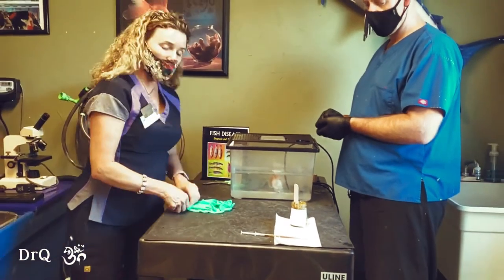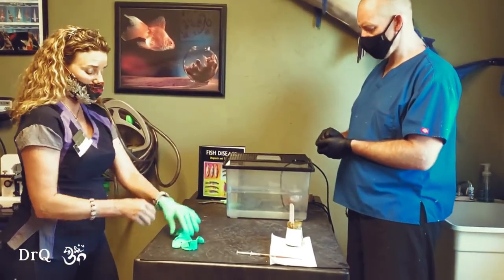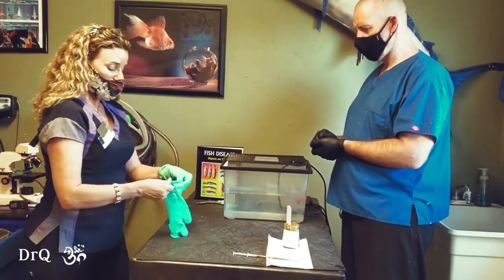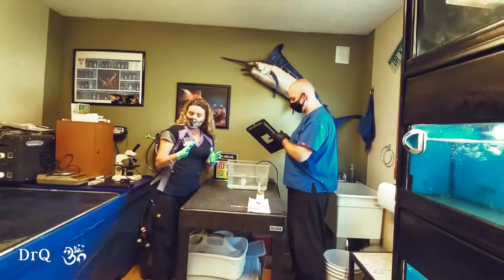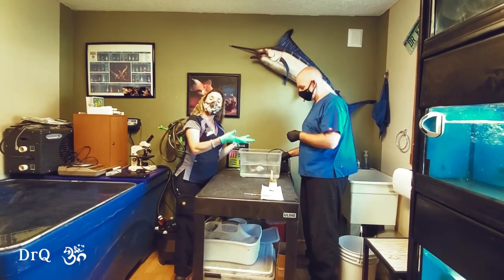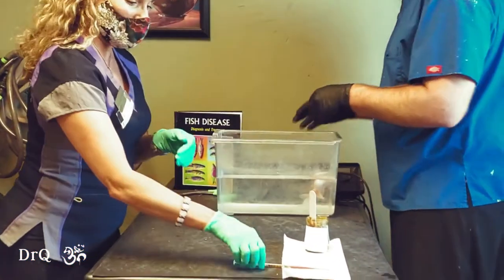Now when you're handling fish, you always want to wear gloves so that you don't injure their scales or their fins. Jeff's going to help me here. You never want to use a net to get a fish out. You're going to use a bowl or, in this case, just our hands. Jeff will get her out for me.